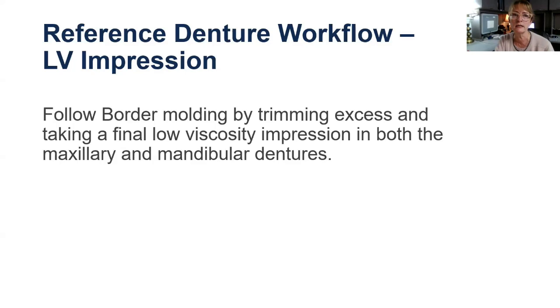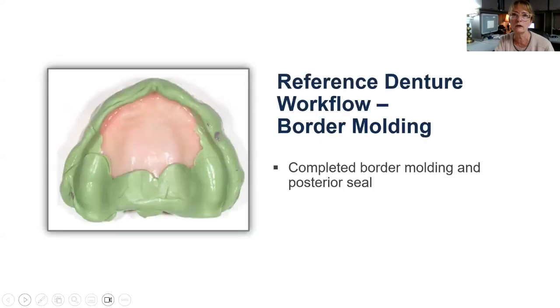Okay, let's continue with our workflow with some different images than my little demonstration guy here. So again, this is a reference denture. This is border molding with the heavy body impression material.